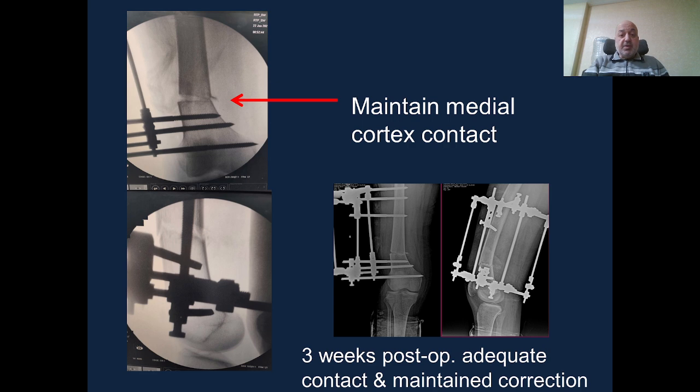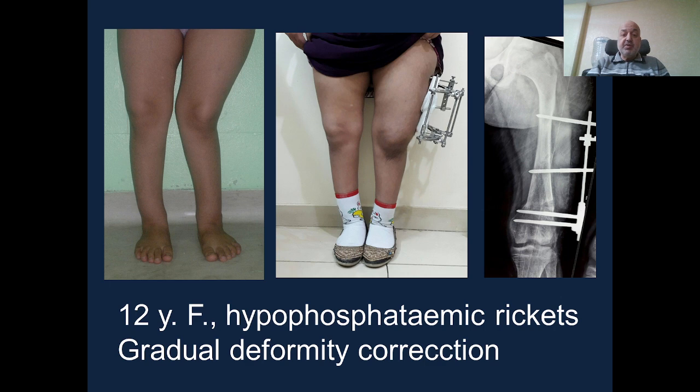As we see here, we always maintain the medial cortical contact. After 3 weeks post-operatively, there is adequate bone contact to maintain the correction. The patient started weight bearing.